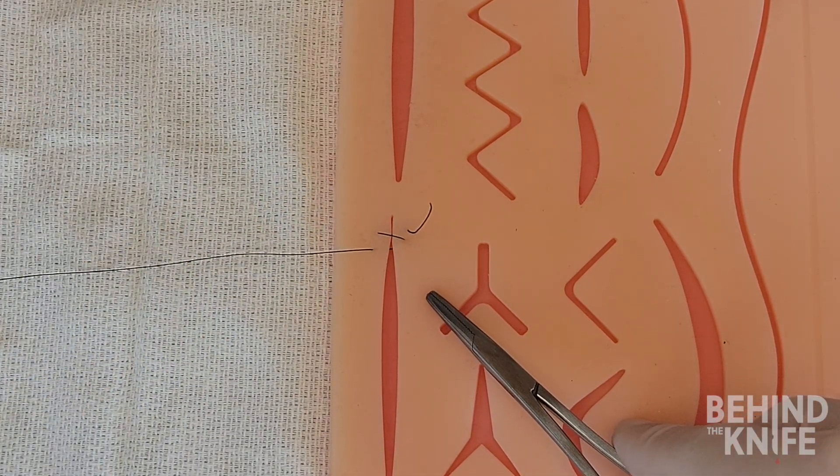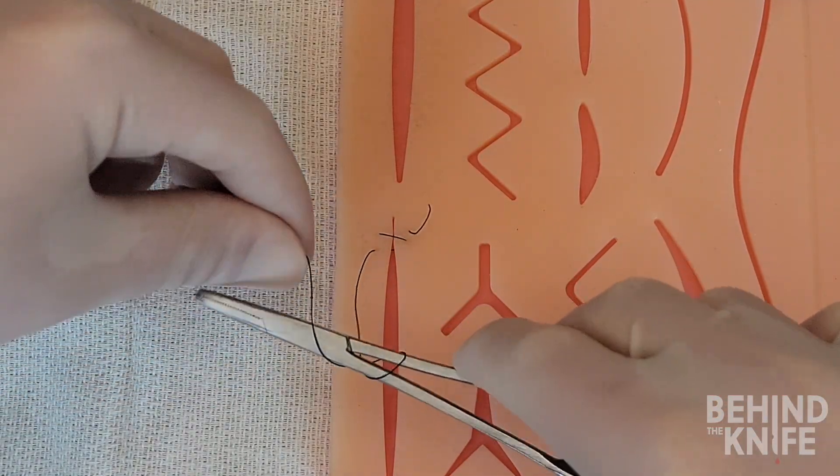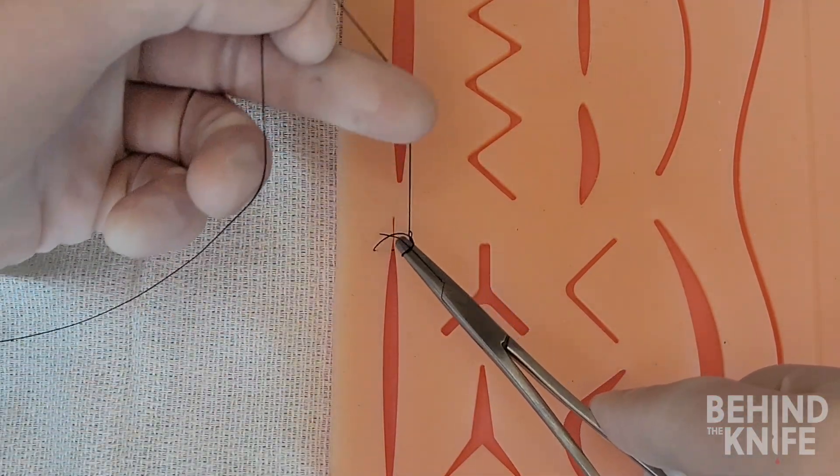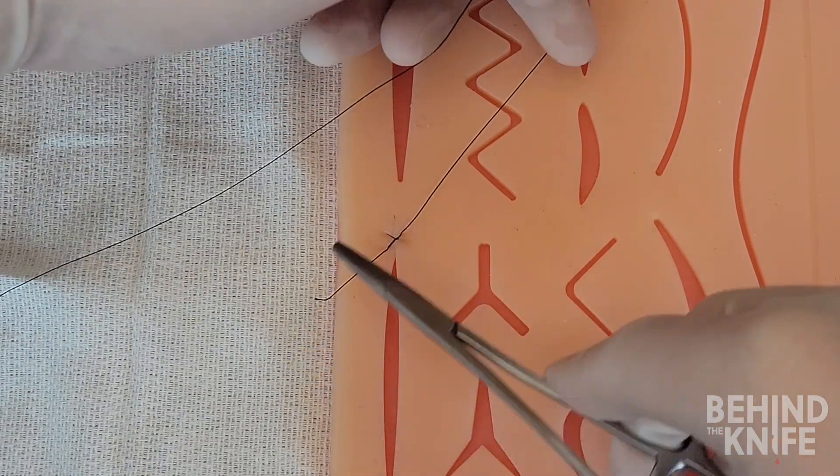We are going to instrument tie these two tails together at this point. You will see as we tie this knot down, the suture will be crossing in the middle and creates the shape of a number eight, hence the name figure of eight.